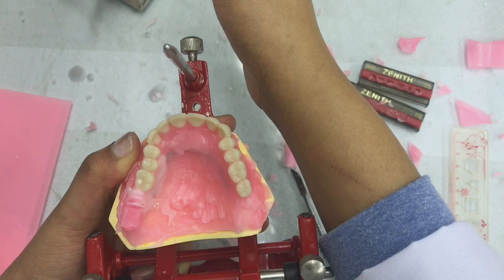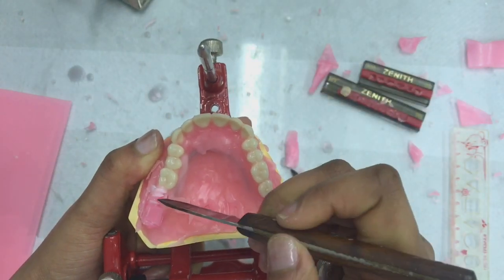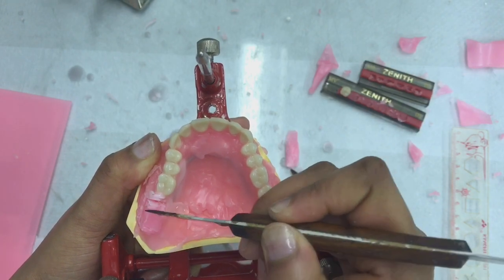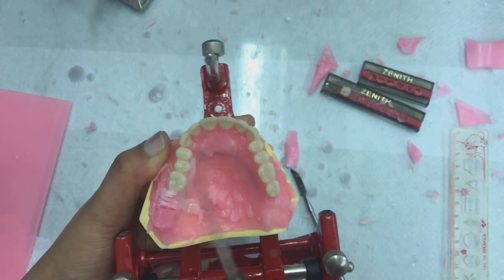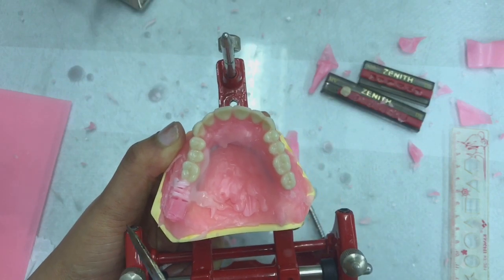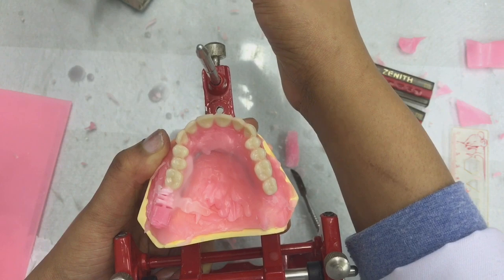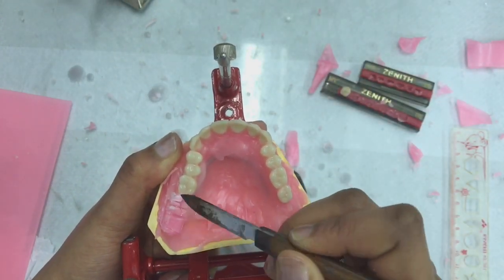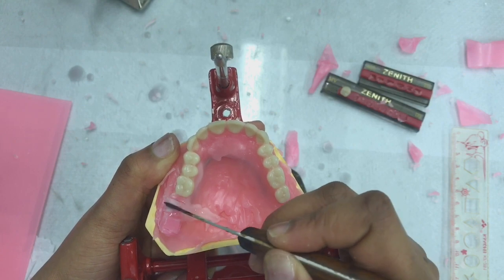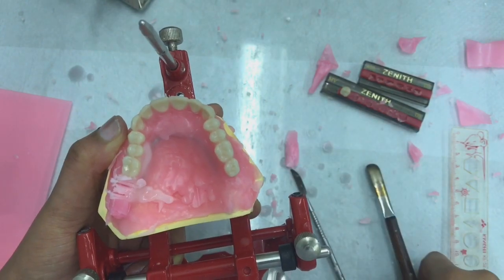Another thing that you need to be mindful of is as you are setting up your posterior teeth, there should be symmetry between the quadrants. So as you're looking at my quadrants, you're going to see that there is symmetry. If you find that you are setting up your posterior teeth and there is no symmetry, you need to then find the cause of the lack of symmetry.